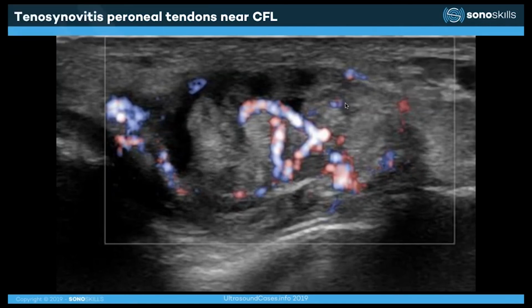superior moving of the peroneal tendons. So it's like a hammock being stretched, straightened, and this pushes up the content. So this pushes up the peroneal tendons. If you see the tendons moving upwards, then you know that the ligament is still intact, pushing from underneath. In this case, a lot of Doppler activity and also swelling of the peroneal tendons.